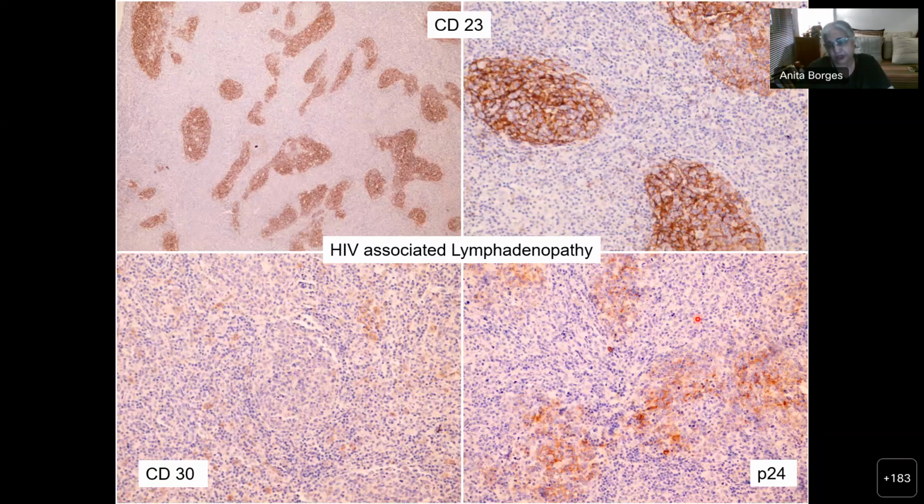So never forget that HIV is something you have to keep in mind. In the days when we had this HIV lymphadenopathy, yes, we did P24, but at that time we did not have EBERs, and EBV is not always the best way to show it.